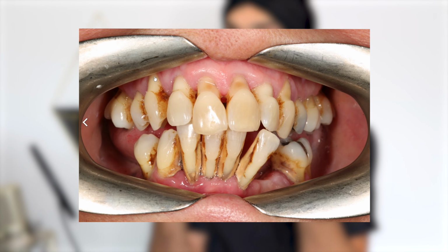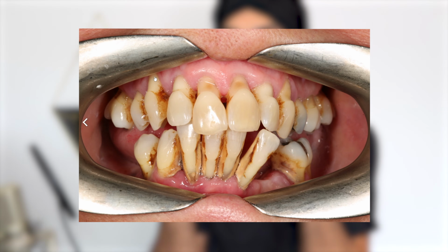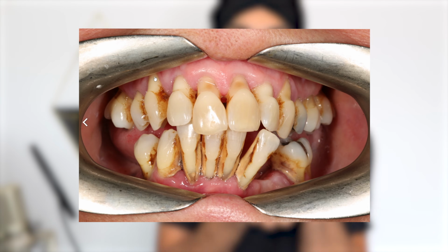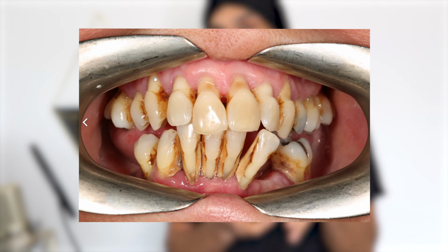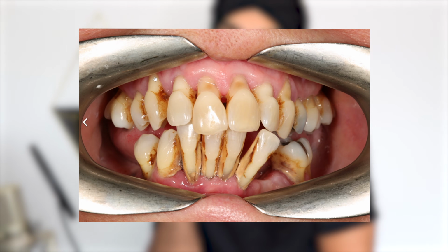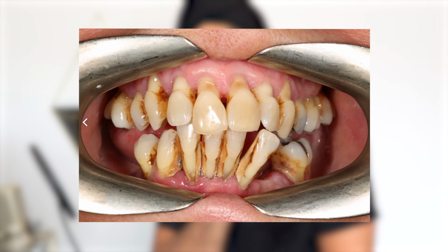When we look at a CT scan, that's going to be important. Now, you can probably guess from a photo like this that this patient hasn't got a very stable bite. They probably bite in several different positions depending on what hurts and what doesn't. These are the situations where we need to look at recording the bite in a different appointment. If you've ever had a denture made, there's a part of the process where we ask the patient to bite on wax blocks, and that helps record our bite.